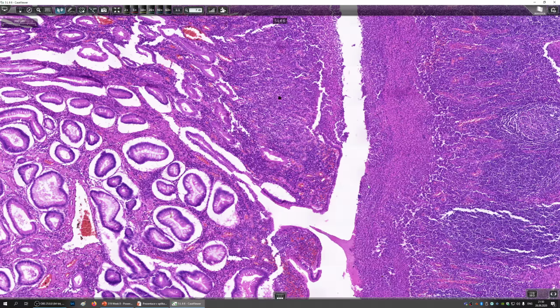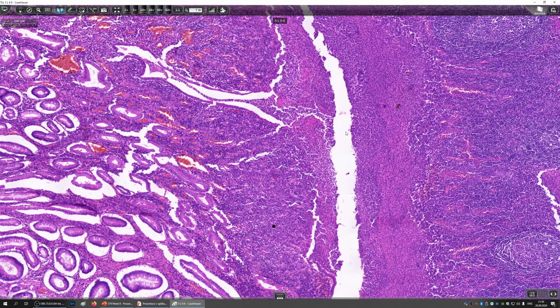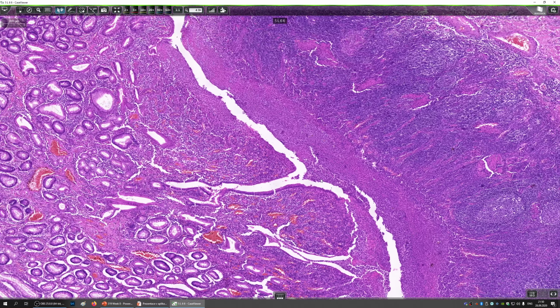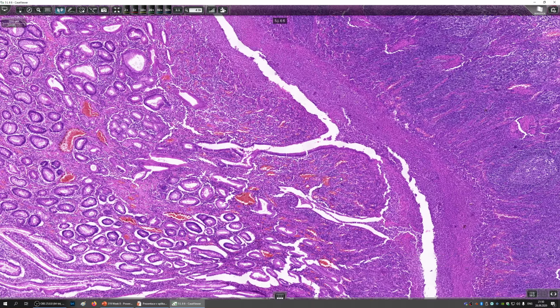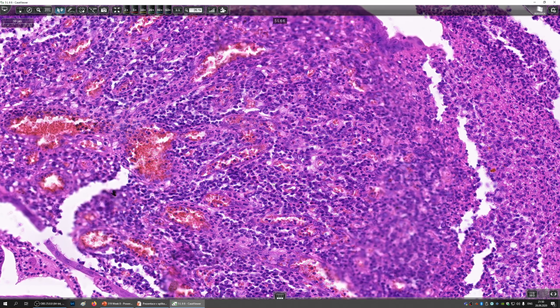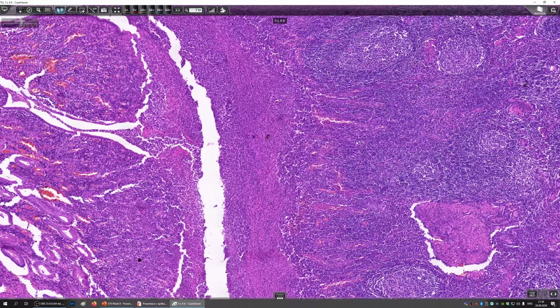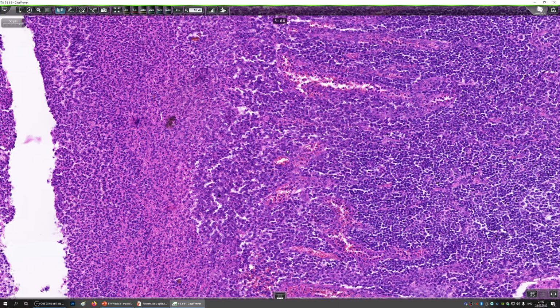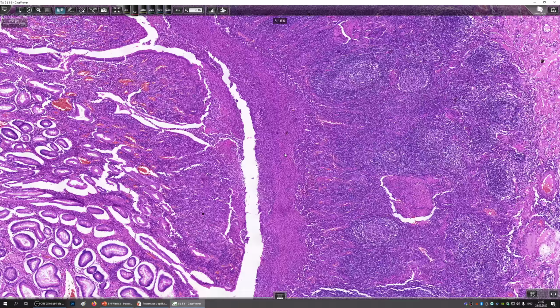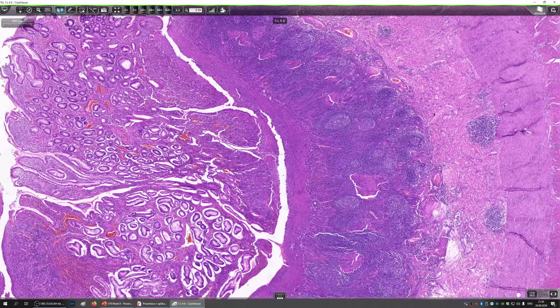Patients with IBD usually have bloody diarrhea, let's say 10 times a day. That's quite typical. So there's huge ulceration. And there's a lot of granulation tissue here. You see, this is all granulation tissue. You see the blood vessels and a lot of inflammatory infiltrate, which is quite dense. It's mixed, mostly lymphocytes and plasma cells, but also many neutrophils, especially at the ulceration. So one of the signs of active IBD is ulceration of the mucosa. These ulcerations can be quite deep.